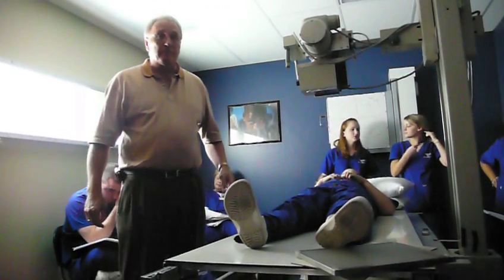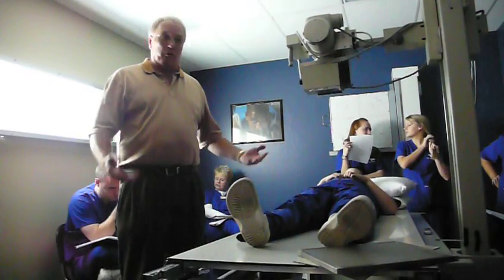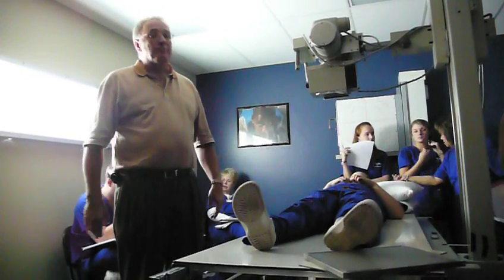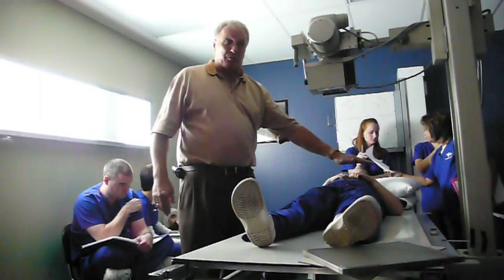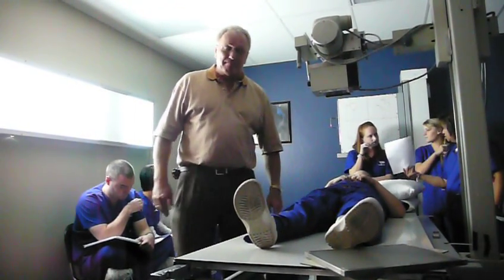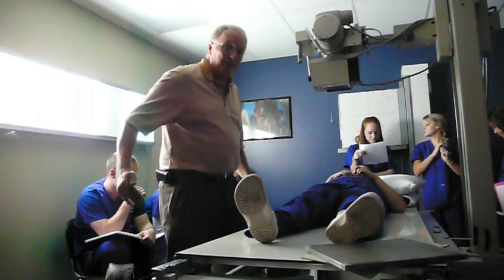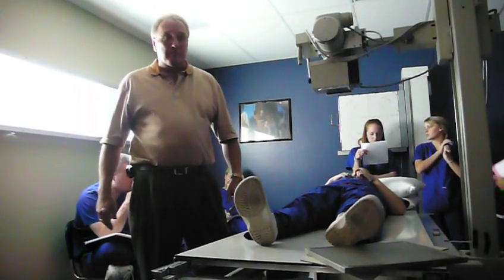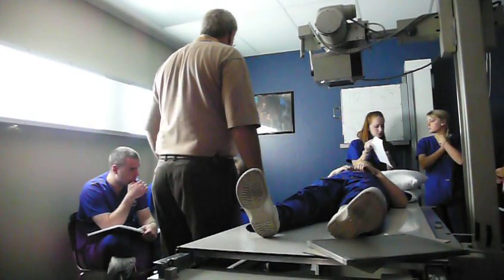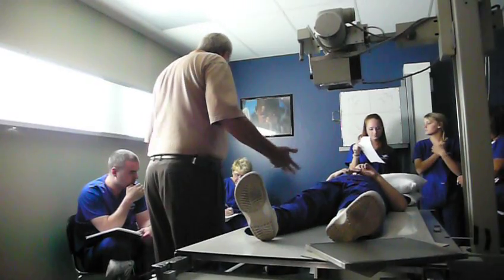You don't want to try for axial lateral, the cross one. No, you don't move it — whatever you can get. You'll do an AP just the way they're laying, and then you'll do your cross table. The reason we call it cross table is we're shooting across the table. And is that the axial lateral?